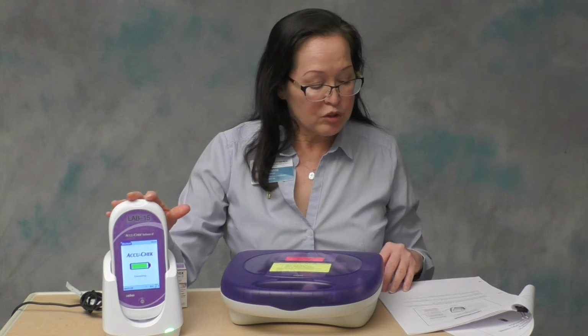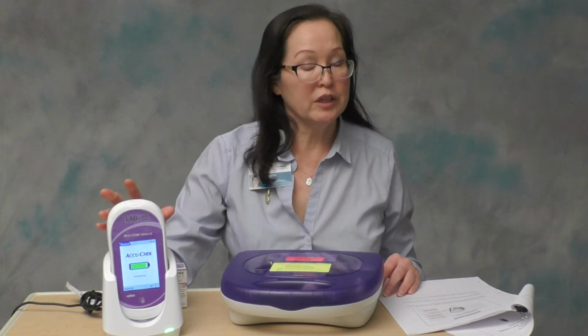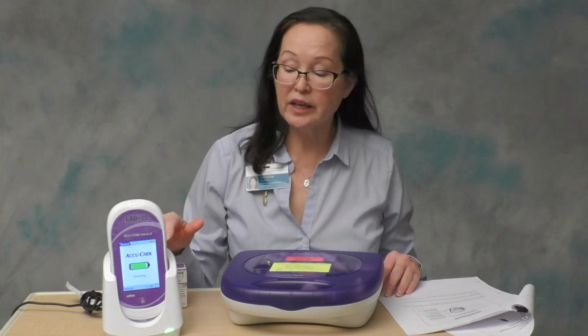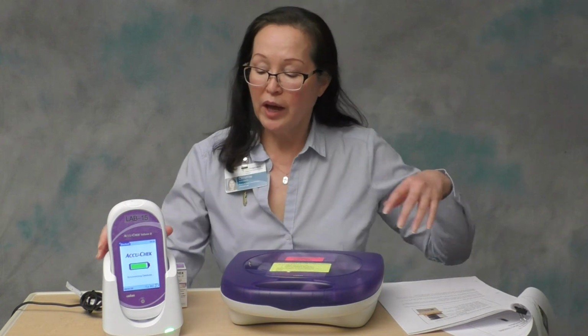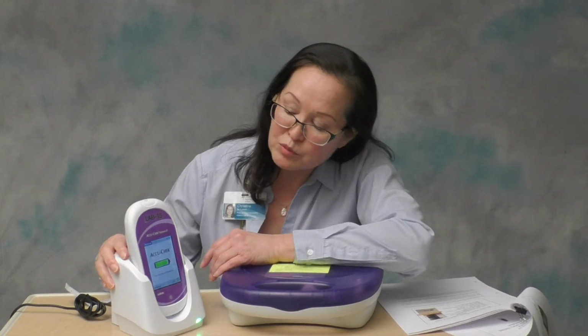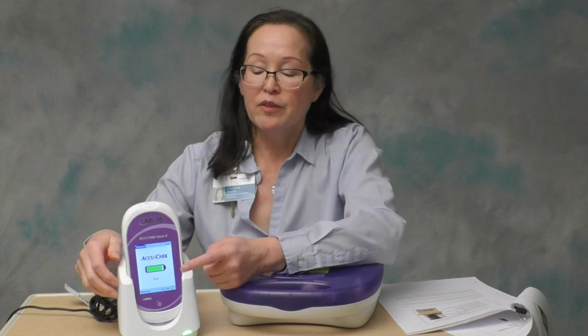There is a certain display that must be observed when you dock the meter into the base correctly to indicate that it is docked correctly and it is recharging. So how do you know if your meter is recharging correctly? You are going to see this display. There'll be a tab in the upper left-hand corner that says docked. There'll be a large battery icon in the center. The color of the battery icon may be green, yellow, or red.